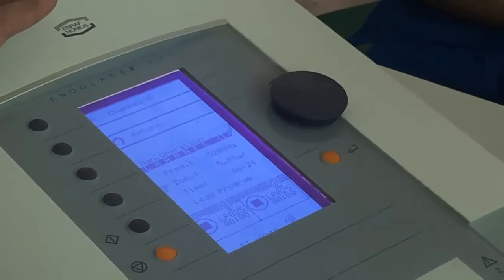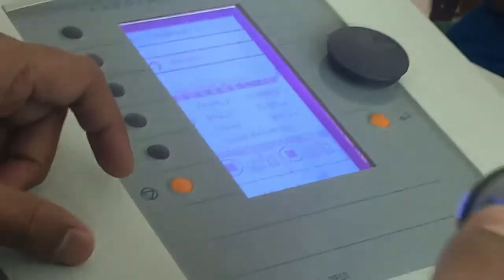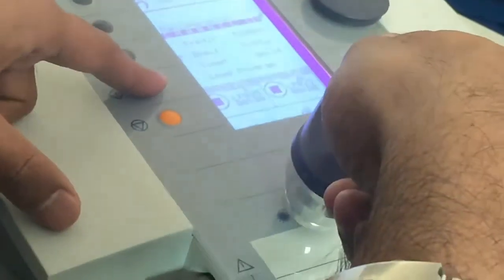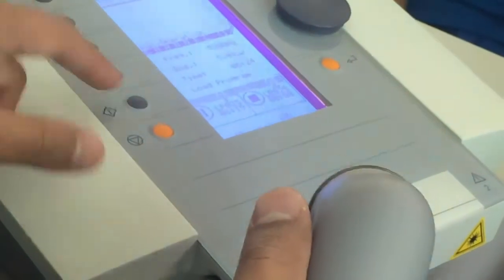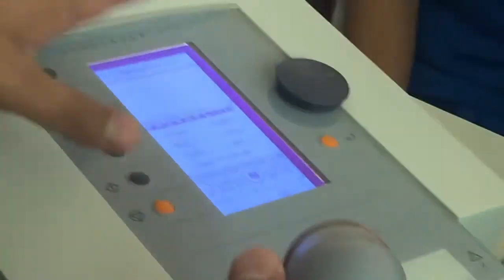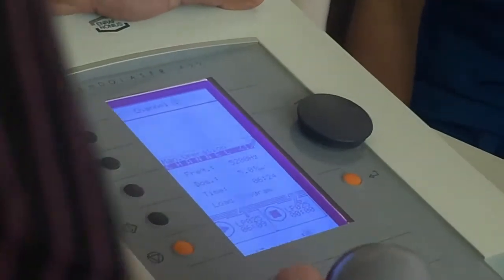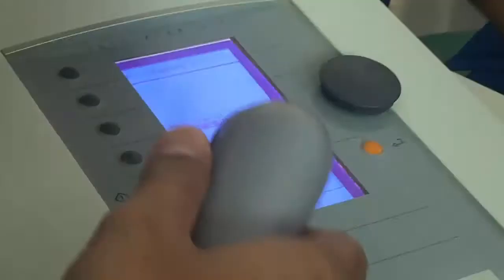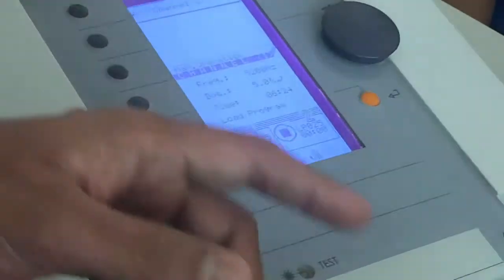Okay. So that open. Start. But how do we start the beam? See, here, test. You have to put here. Laser activated. Red light. Now stop. Now start. Stop. Understood? Once it gets to 6 minutes, then it will become normal. Now I can't, because again 6 minutes is there, so I have to stop the mains. We can stop it and resume it from time to time. Stop now. I can start again.